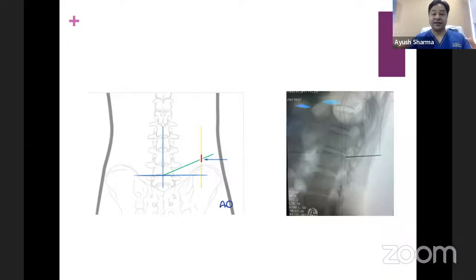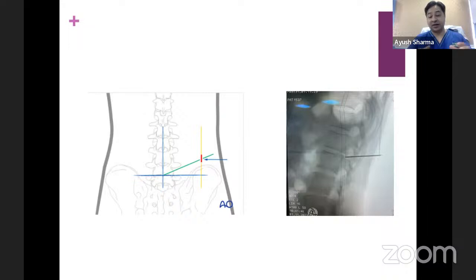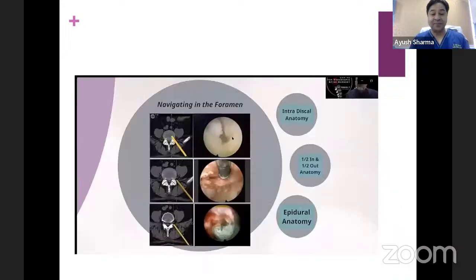So you need to understand the size of the patient. You need to understand what is the area you're covering. And you have to consider the iliac crest, like the way my previous speakers were talking. And considering everything, you have to plan a surgery, and it is a targeted surgery. You have to hit the bullseye, which is the pathology, and that is where the fun of becoming a transforaminal endoscopic surgeon begins.